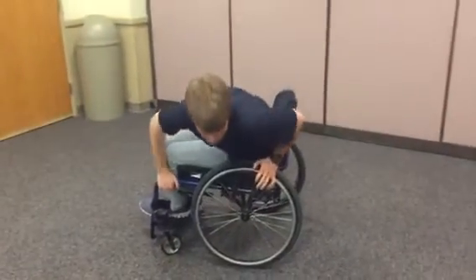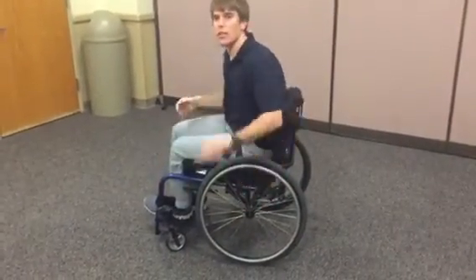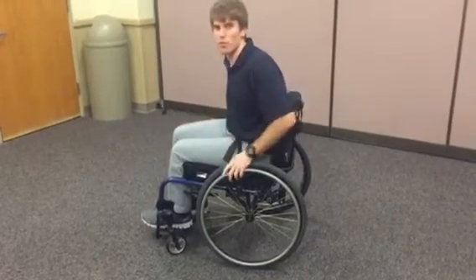You can see how far over I was in the wheelchair to be able to perform that — that's where the range of motion comes into play.